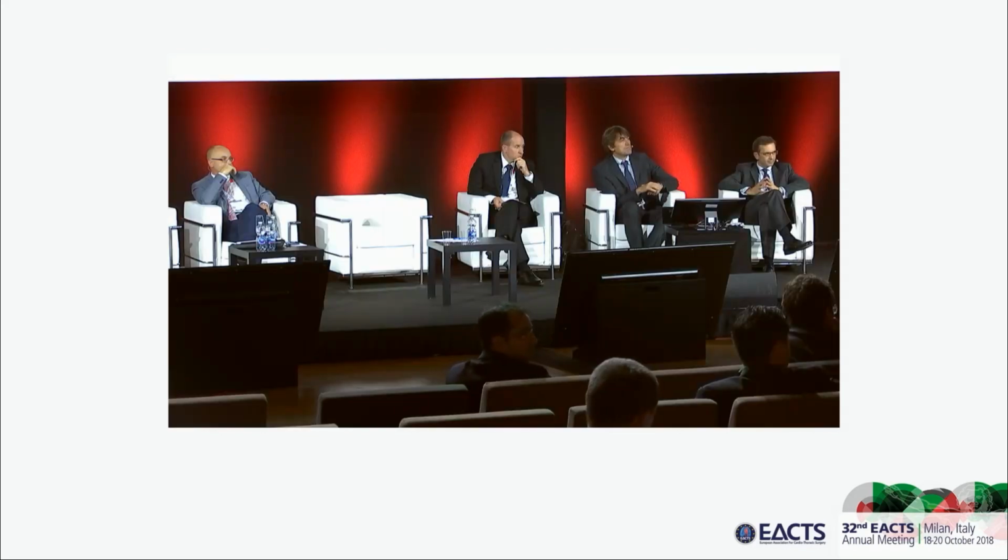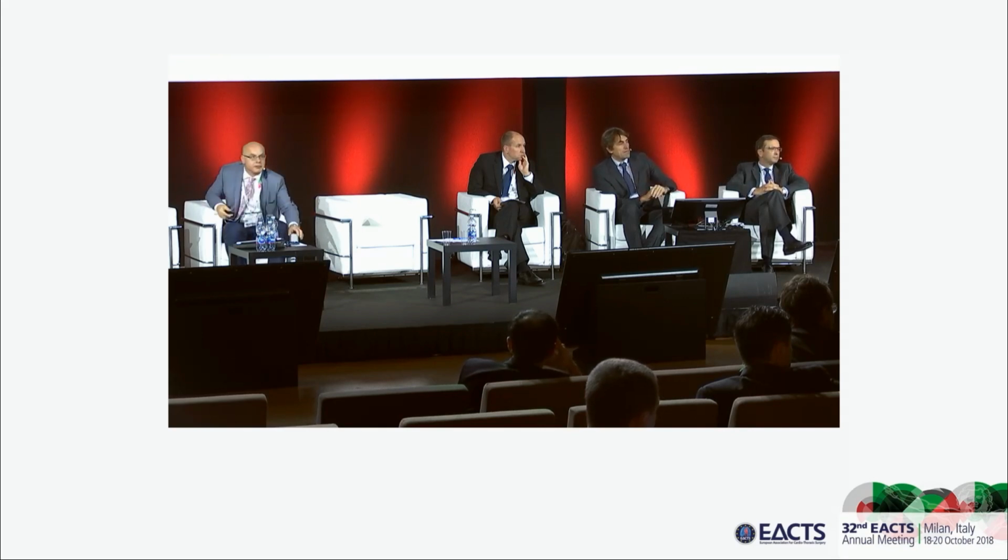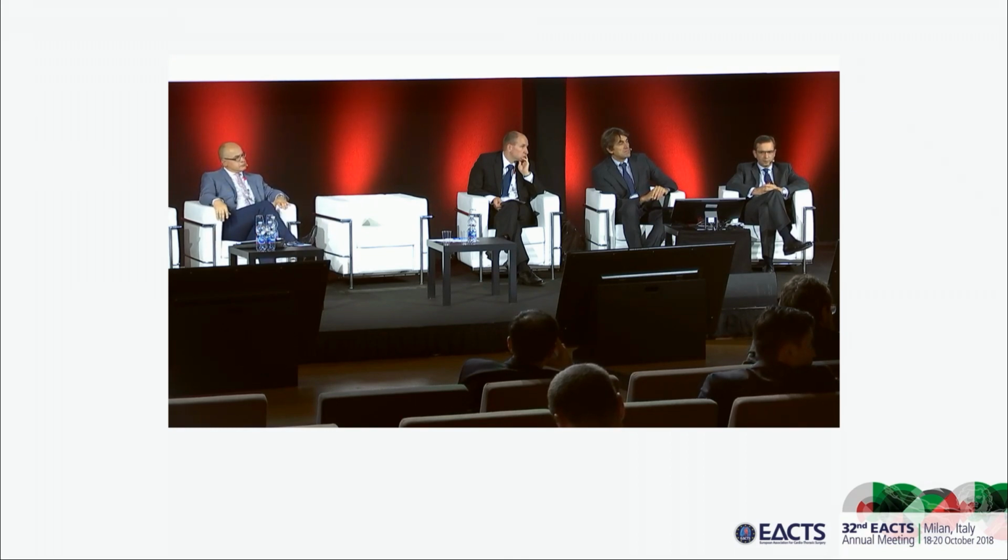So Schäfers. Maybe just a confirmation of what you said, because there is one thing that I think cannot be overestimated. This multiplanar reconstruction is essential. Yes, it takes time to work your way into 3D assessment, and these spatial 3D images are nice to look at, but the true importance of 3D, and this is so vital for adequate repair, is multiplanar reconstruction.